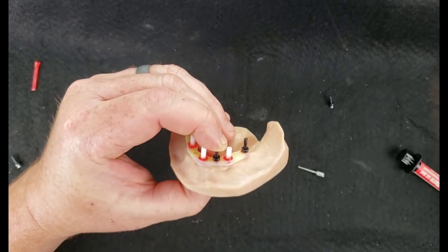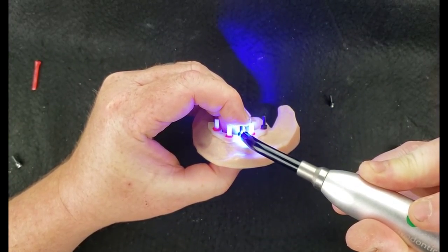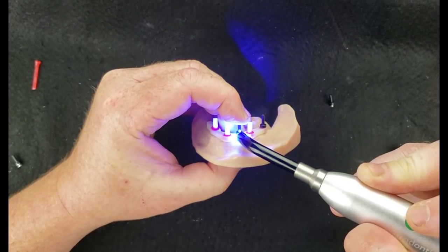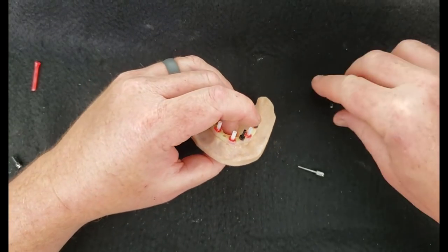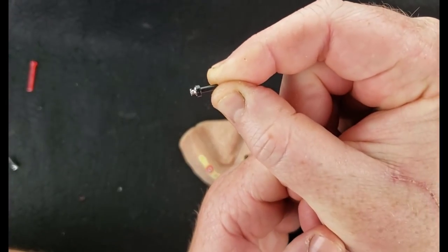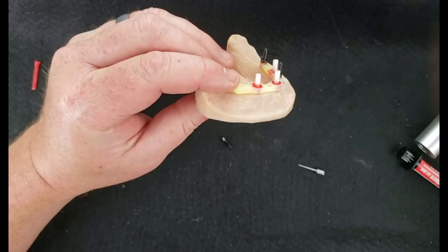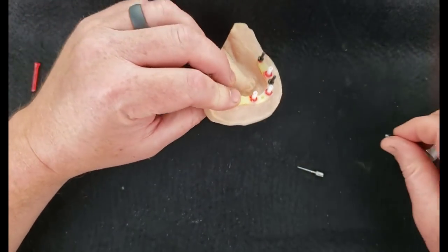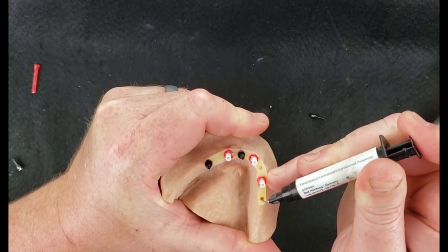Now the way this whole process works is that when the lab takes this final object, it's just going to be one big piece of resin with the implant connections also being in castable, in this case plastic, those little white cylinders. But then these metal objects, the locators, are going to be metal. So obviously they're not going to burn out, but do you see how there's this retentive shape to them? I don't know how well you can see that. That retentive shape, when they burn all of this out, it's going to leave a void, and the metal is going to get cast in and around that, and that retentive shape is going to embed that inside of the metal. So from your purposes, it will all be one single piece once it's been cast and divested.